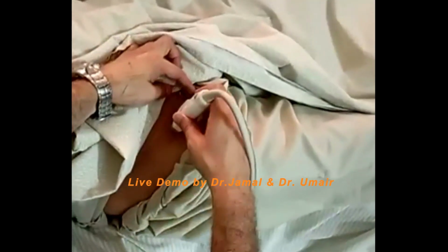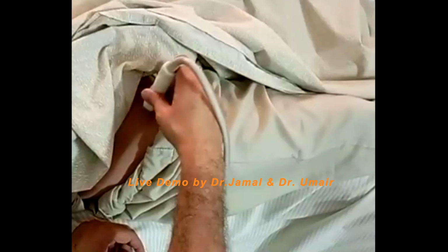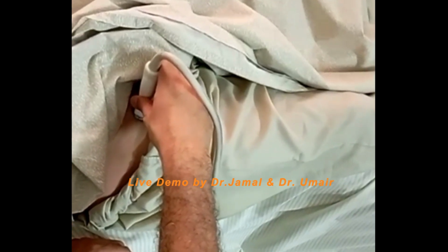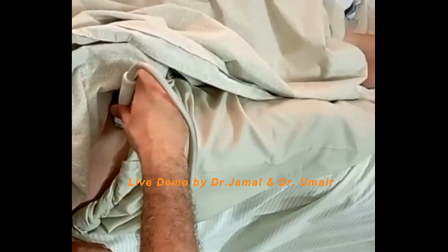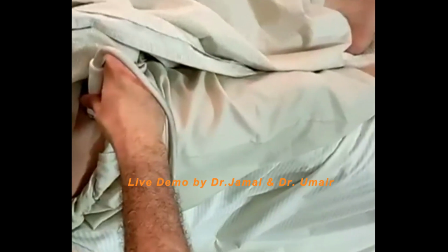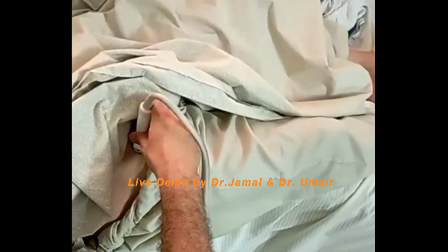We can see here, and we will keep the marker part towards the medial side. We'll keep it along the inguinal canal. And once we keep it here, we will locate the femoral artery, a round pulsating structure, and medial to that will be the femoral vein, and lateral to the femoral artery will be the femoral nerve.